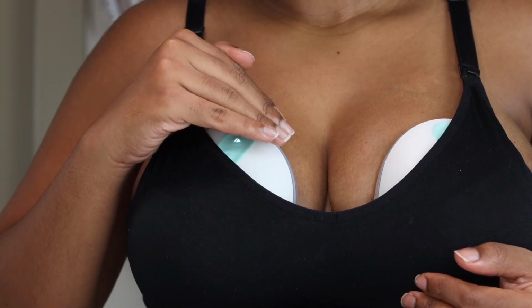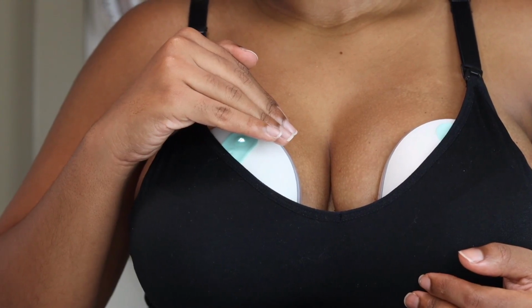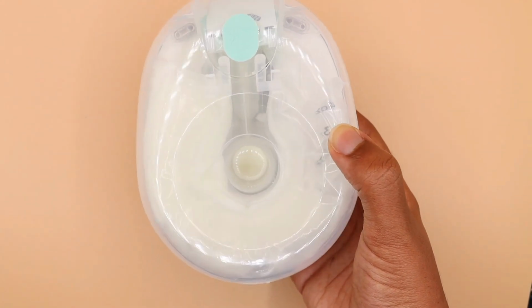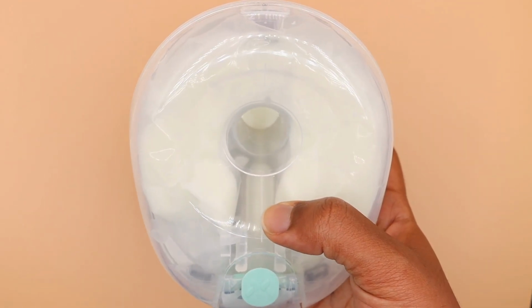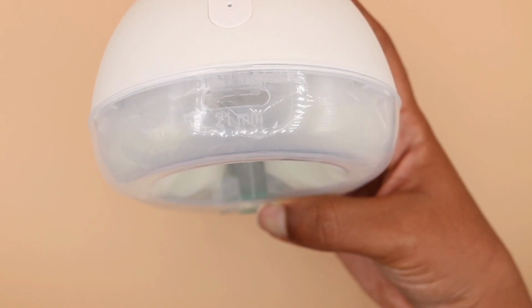After 25 minutes, the Willow breast pump will go on pause. Now you can continue to use it for more than 25 minutes if you need to, but it will stop at 25 minutes. So as you can see here, this is all the milk that came out when I pumped. So now all you have to do is turn the actual pump upside down, and it is going to make sure all of that milk gets into the bag.